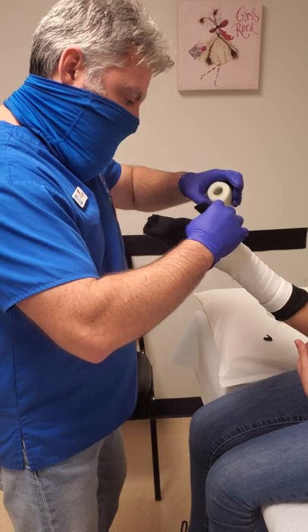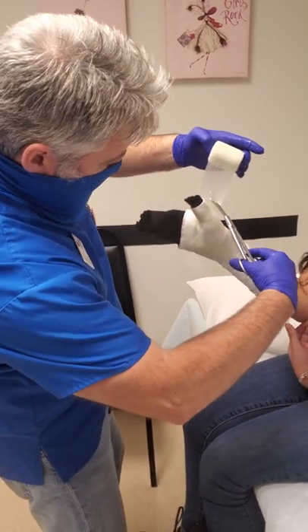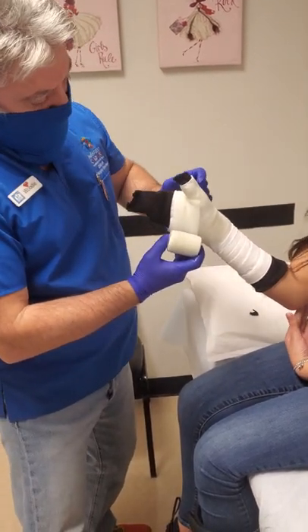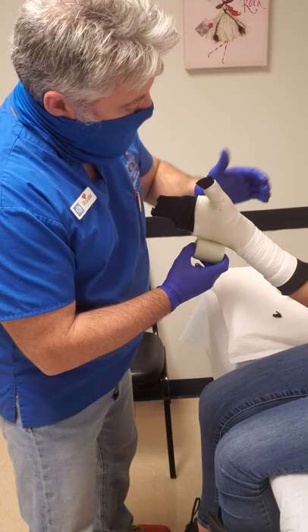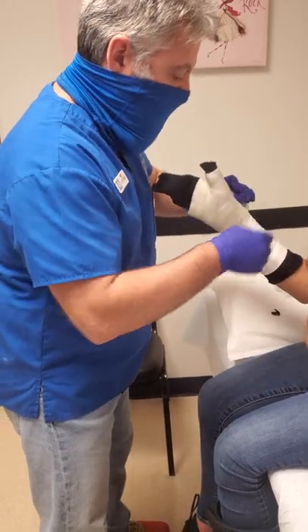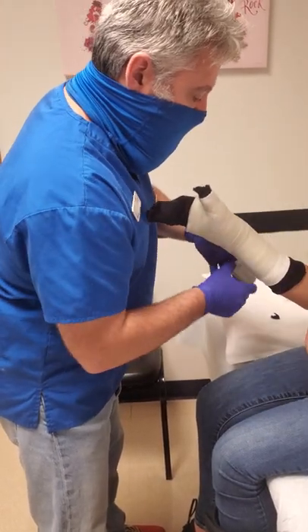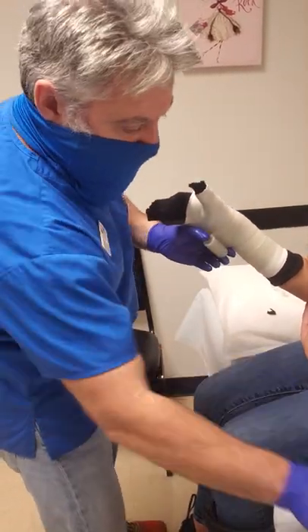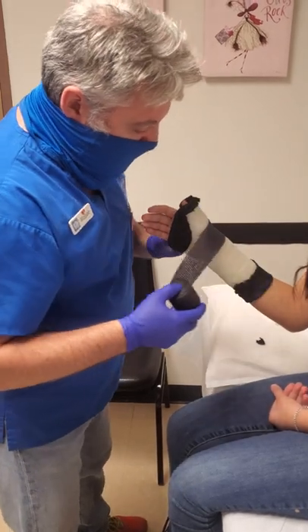As they get older — teenagers and adult size — you can probably go through it twice. Especially the boys, football players and girls in volleyball, real athletic teens: you want to reinforce it at least twice just to have a nice sturdy cast. So the first cut I started with I finished with — first cut, wrap twice around the thumb; second cut, leave the little corners exposed like that. Just like we did with the previous videos, you can see that we don't lay it on tightly at all. We just lay it on there comfortably — it doesn't have to be pulled tight.